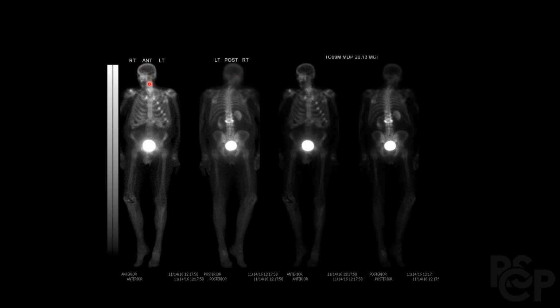And then we work our way downwards and we notice increased focal uptake in the ribs, and it forms a diagonal pattern that goes throughout the ribs like this. Then we notice further increased uptake in the spine and the posterior side over here and over here. And then we work our way downwards, and everything else seems to be normal.